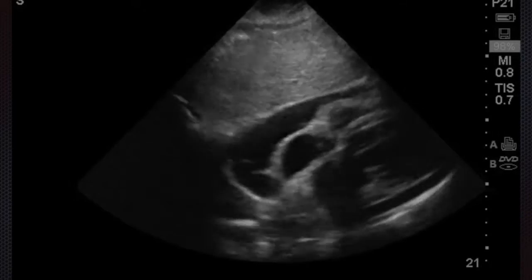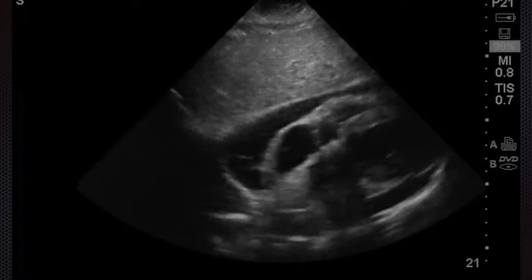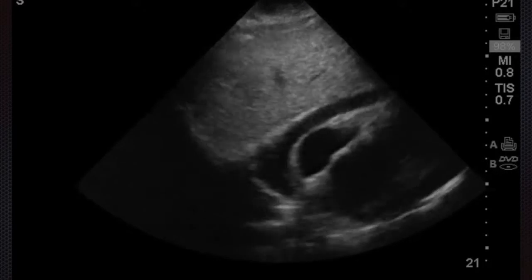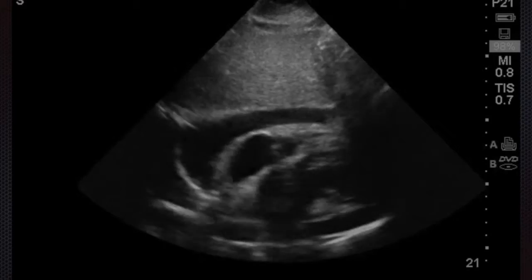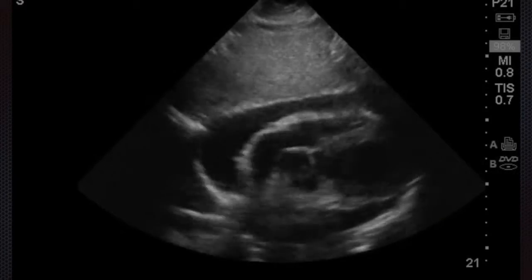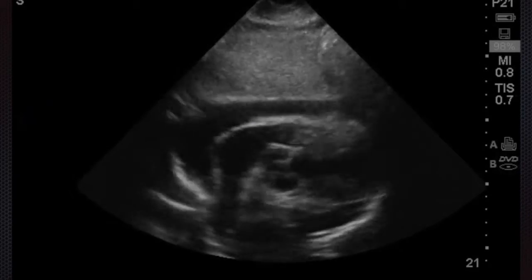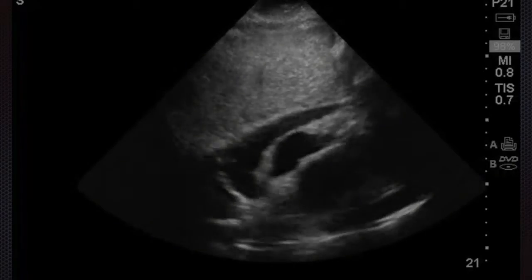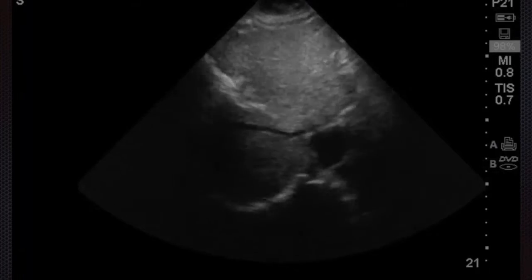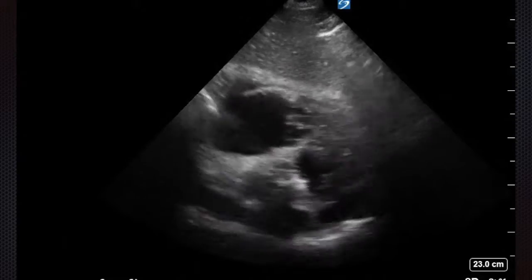Now, not all pericardial effusions cause tamponade of the heart, but you can often see some features if tamponading is happening. And this will be squashing of the right side, certainly the right ventricle and the right atrium, in a sort of a seesaw appearance during systole and diastole. So, you're all happy? You can see the pericardial effusion there? Good. Here's another one.